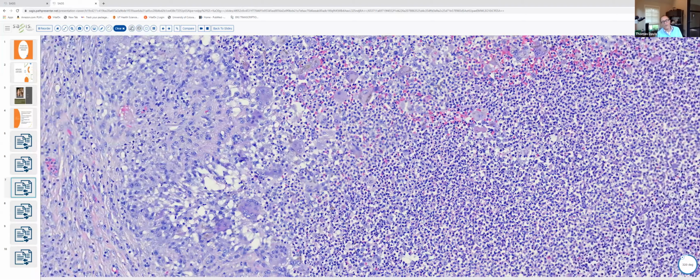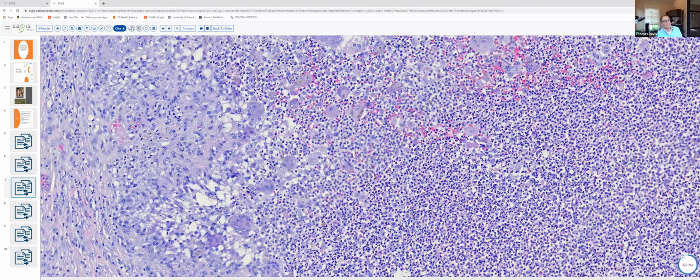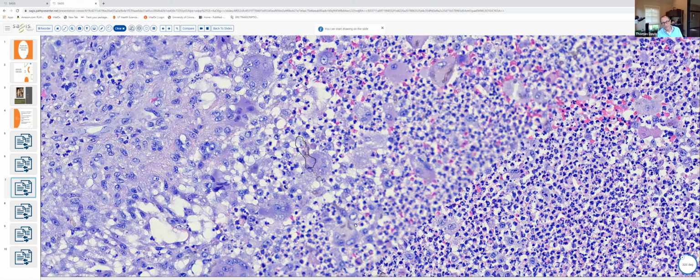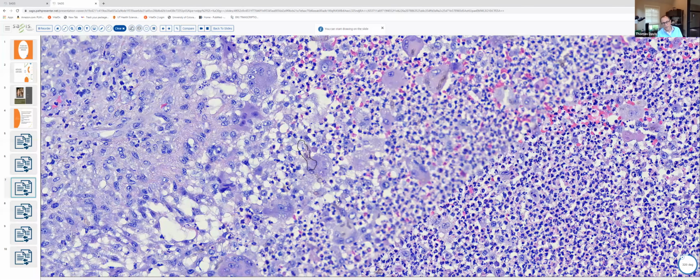And then when we look here in the tissue, we begin to see pigmented septate hyphal elements, which in some of the sections were branching. And this is a distinct morphology that is different from the spores that we saw with chromomycosis, okay?